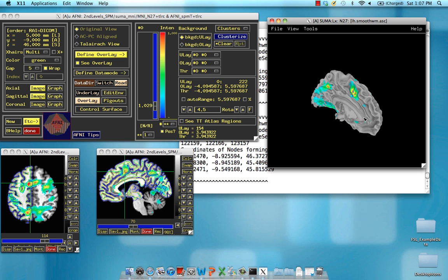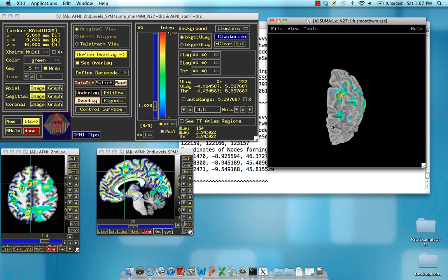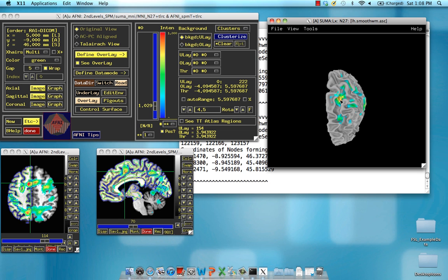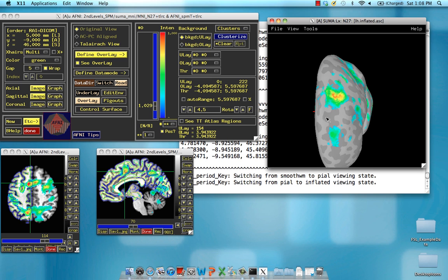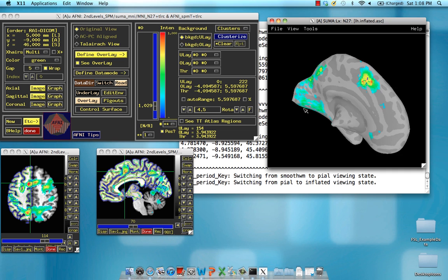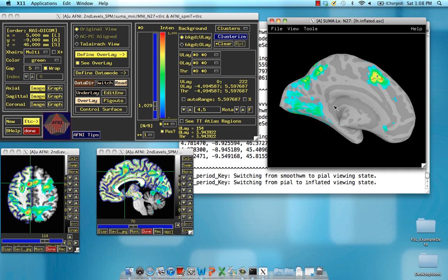Through SUMA, and this is what makes it such an important tool — for example, in this experiment, we said that one of our results was in the superior temporal sulcus. We were using volumetric-based maps in SPM, so it's very hard to determine what is inside a gyrus or sulcus versus on the gyrus itself. But when you map it onto SUMA, you can see that the gray here is the sulcus and the lighter is the gyrus. You can see that this activation on the dorsal side is, in fact, within the sulcus. These images are pretty to look at and can be used to make really good figures, even though you may have processed all your results in another package such as SPM. More detailed instructions can be found on the blog and in a Word document from my website.